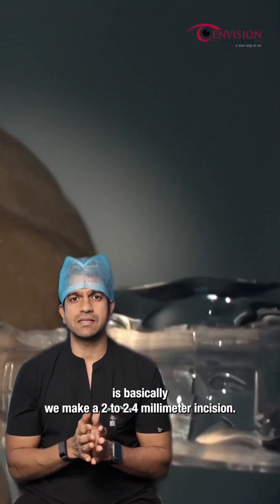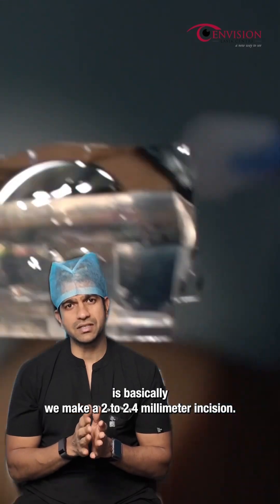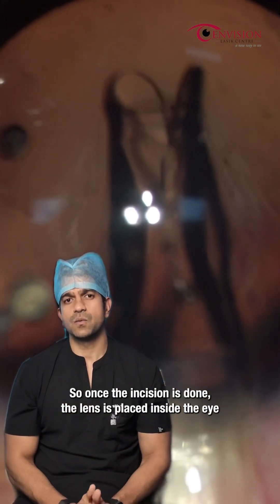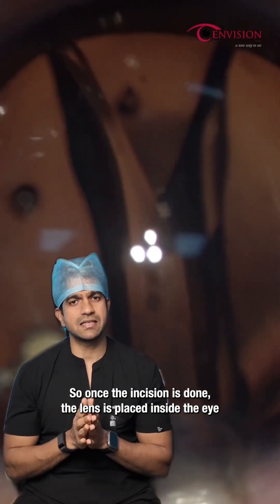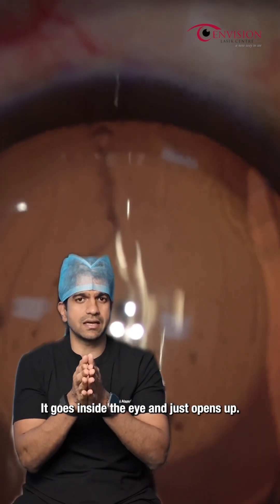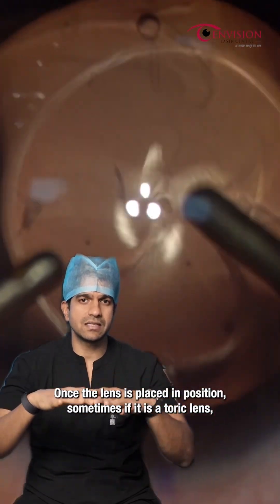The first step of the surgery is we make a 2 to 2.4 mm incision. This incision is so that we can place the lens inside the eye. Once the incision is done, the lens is placed inside the eye through the injector. It's a foldable lens — it goes inside the eye and just opens up.